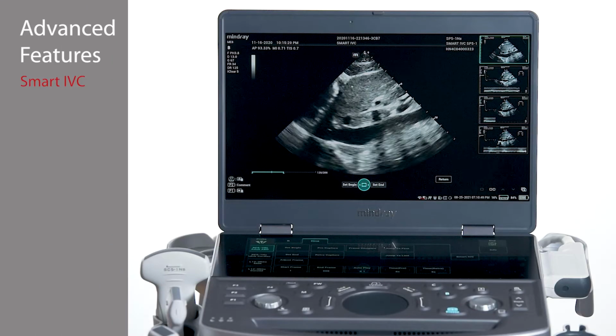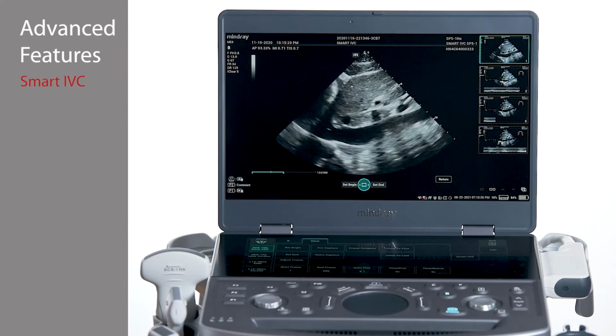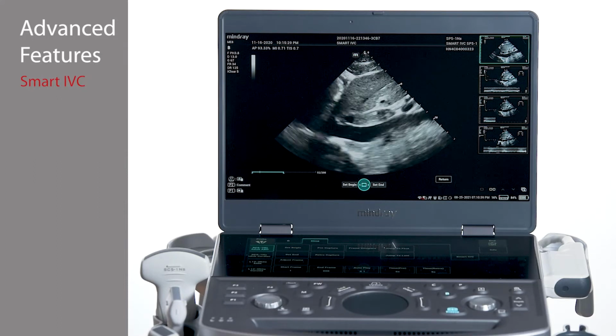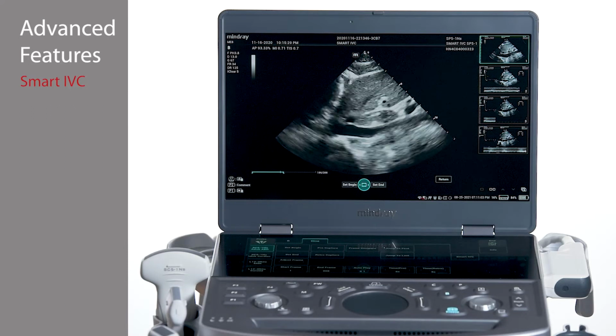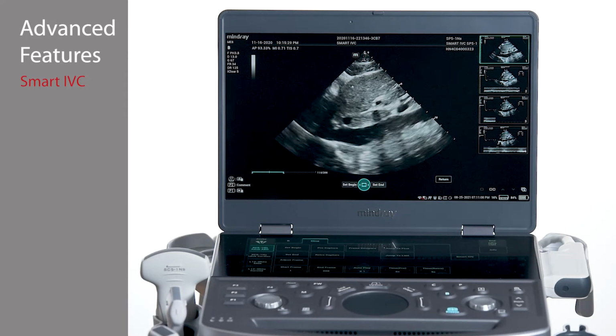Smart IVC is a software option that is used to automatically trace the IVC diameter changes and calculates the collapsibility index for spontaneous breathing and distensibility index for mechanical ventilation. Smart IVC can be performed on real-time images or stored clips.